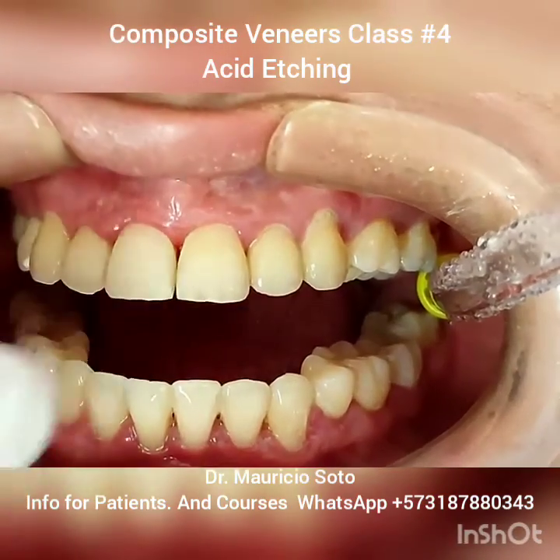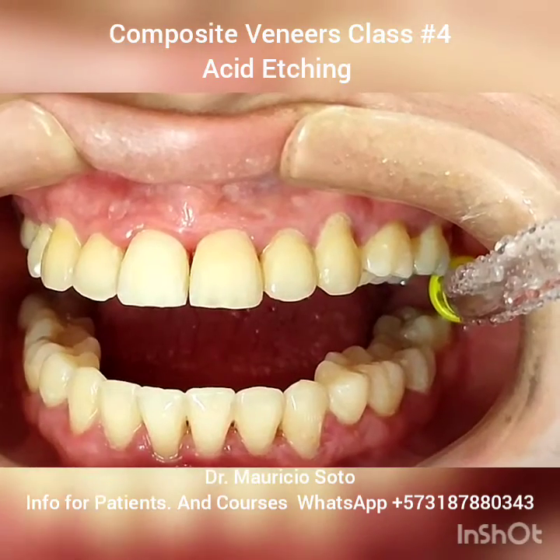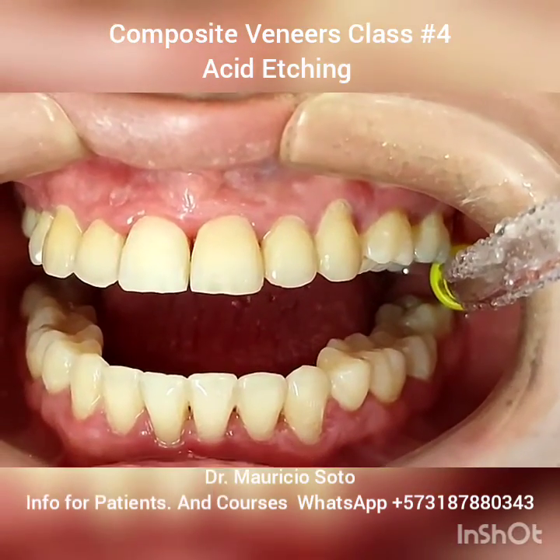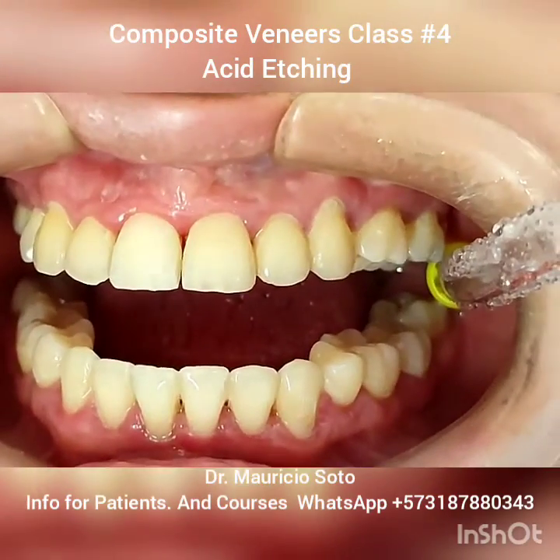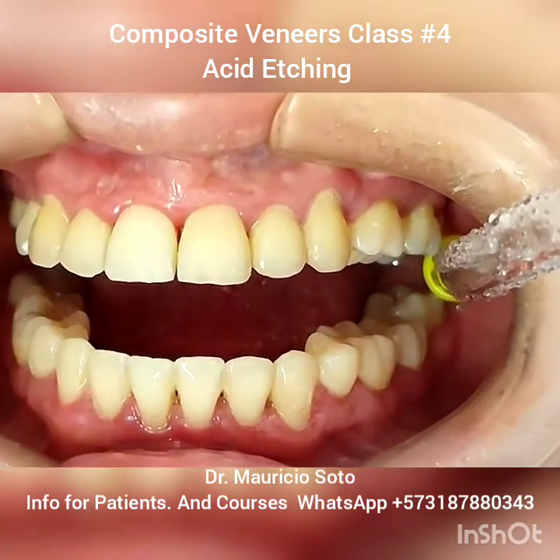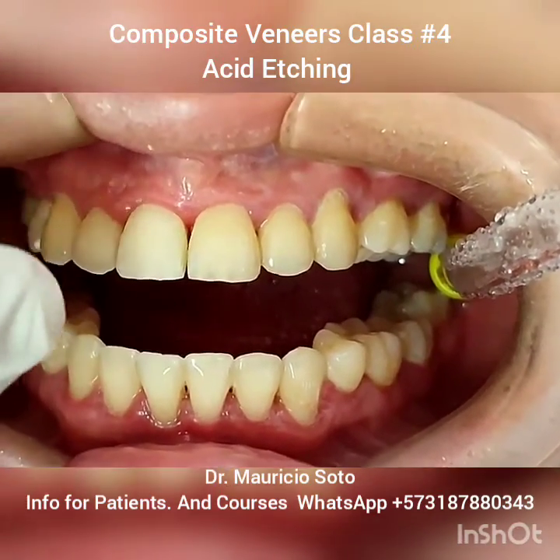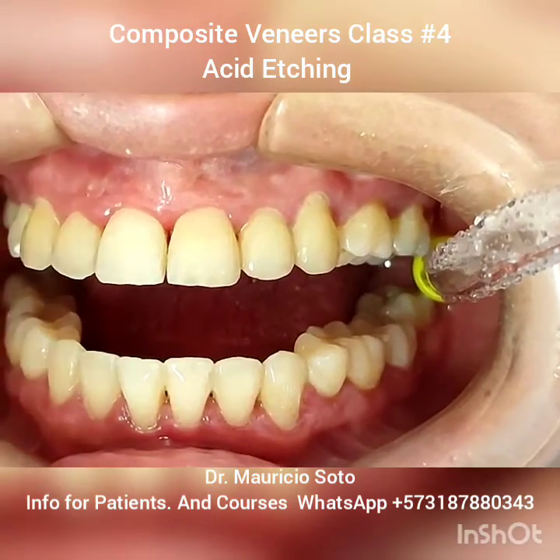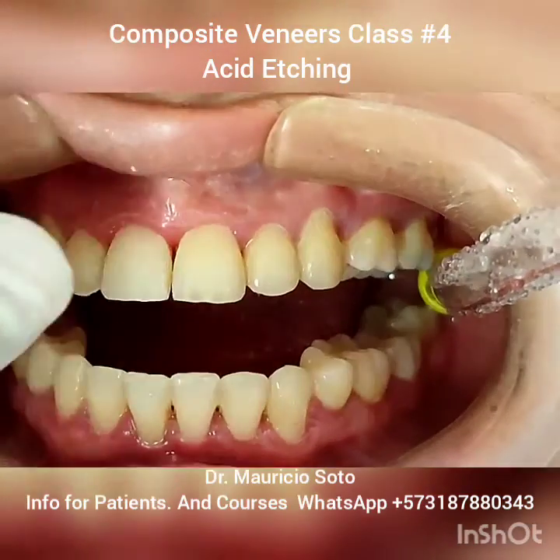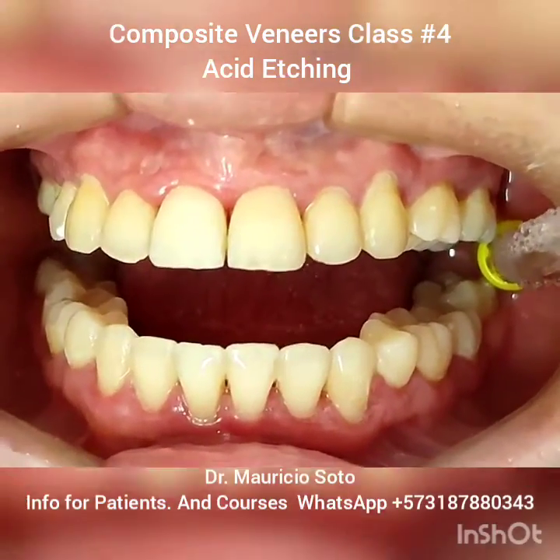Now the tooth is ready for putting the bonding. It's very important that in this part of the process of doing veneers, we don't have contamination with water, acid etching, or saliva on the surface. The only thing that will be in contact with the tooth is the bonding and the composite.